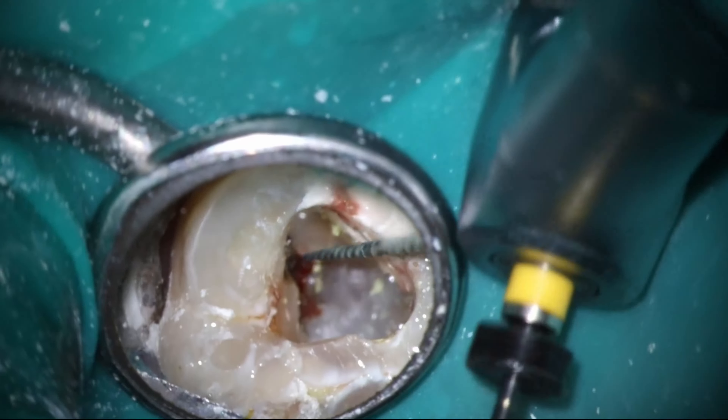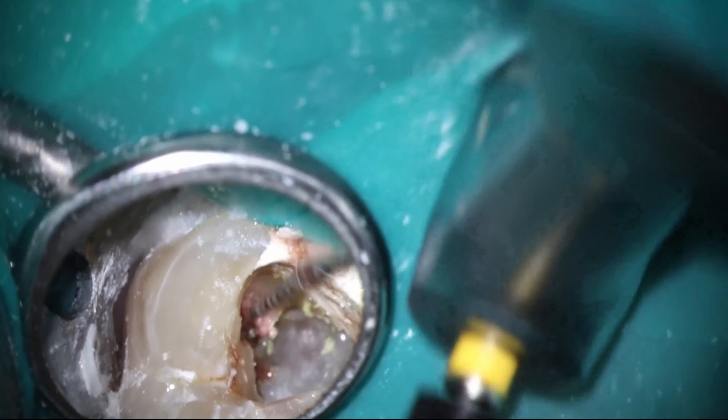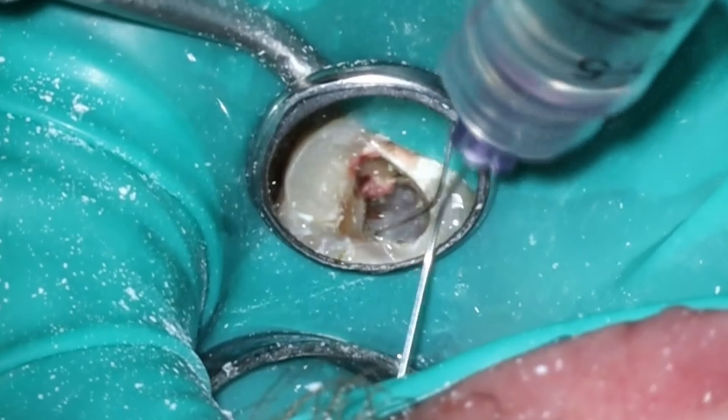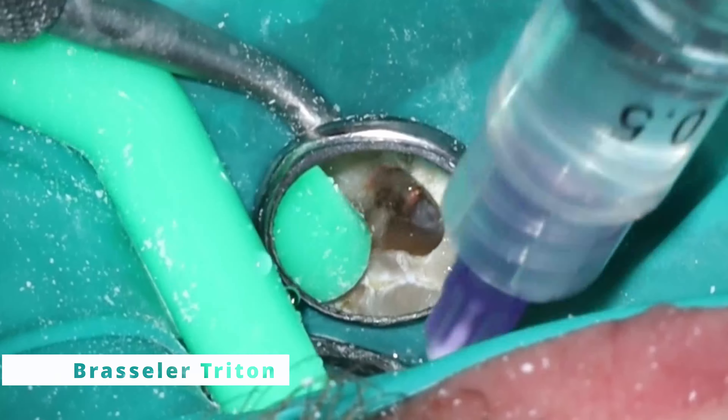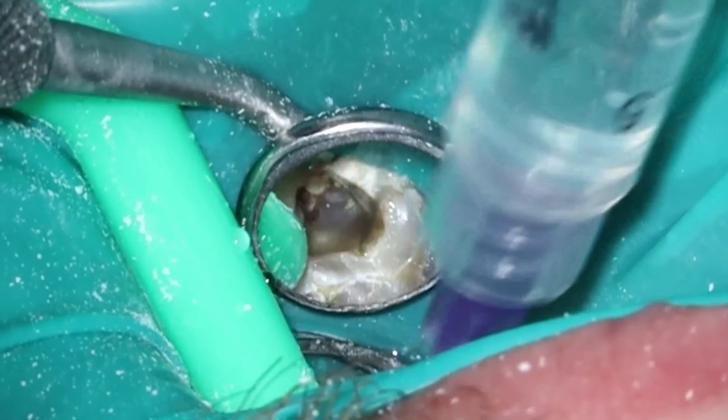That makes a significant difference. It looks like they had maybe taken a couple files down the canal. If you look back at that pre-op, it looks like they maybe had gone slightly down, or maybe the Vitapex just injected inside there. But you can see the tooth is still vital. Thankfully, this patient wasn't in pain, which is great, and we were able to take care of the tooth without really any complications whatsoever.